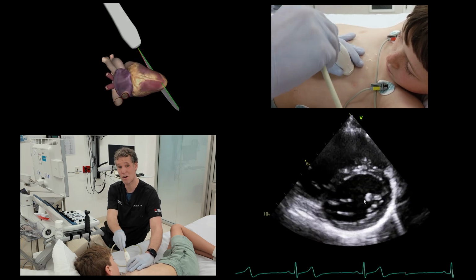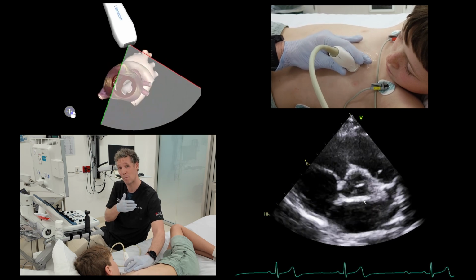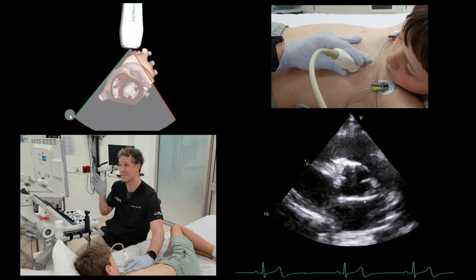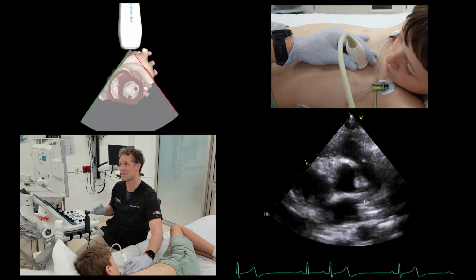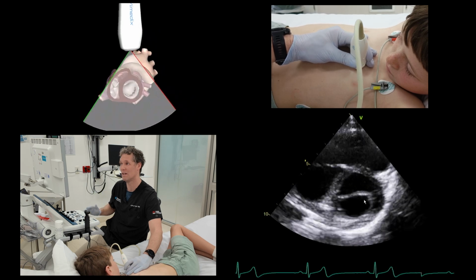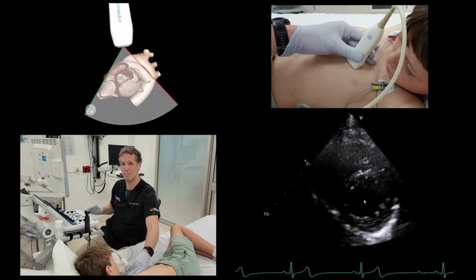And this is often my go-to view for trying to determine if the abnormalities I saw in other planes were present on this one, because this is often the hardest view to sort of mess up. So I start off at that aortic valve level and just fan down through the heart all the way from the top to the bottom.